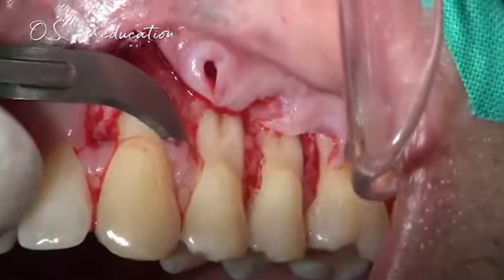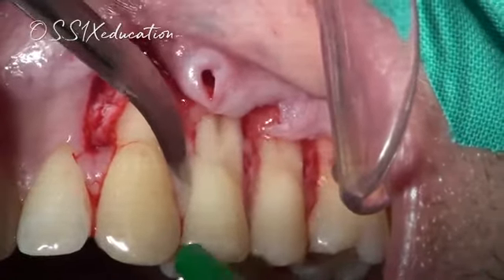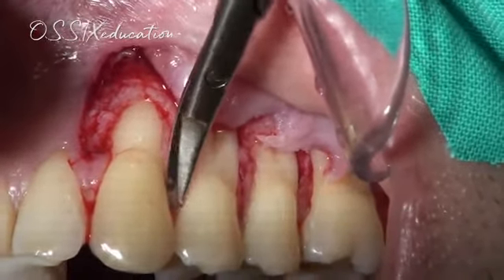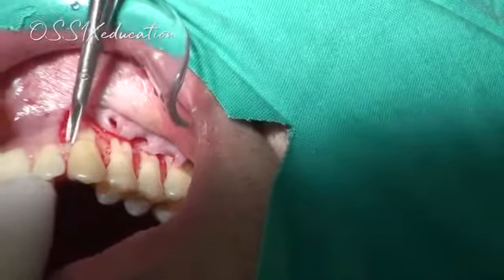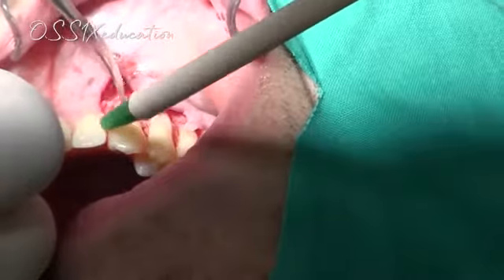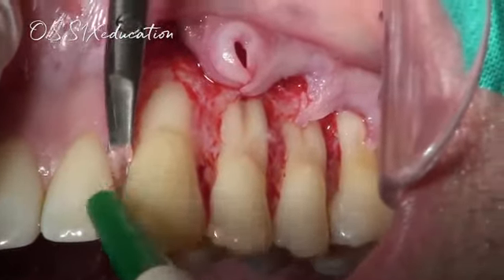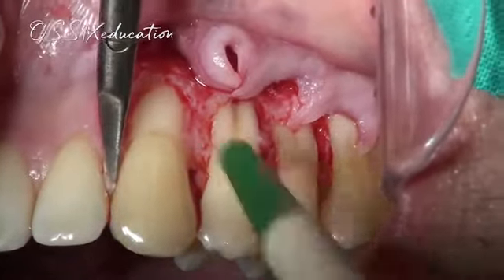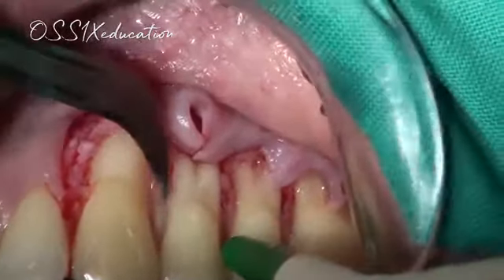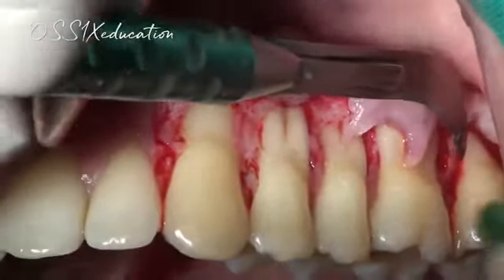Now this papilla here could pose a problem for us because it's very narrow, it's very small, and this is the area where we may have problems with the primary closure. Okay, now we continue de-epithelializing the papilla. Okay, let's recheck that we're sure that we got all of the epithelium away, even from the tip of the papilla. As far as I see.